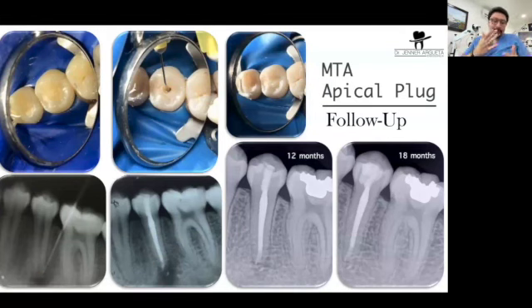Some people say, and this is important to analyze, because I have students, I have people that maybe I meet during my lectures, and they say, you know, Jenner, the microscope is nice, the microscope is good, but I have been practicing dentistry for 20 years, and I have good clinical results. If you only think about clinical results, maybe you will obtain good results, but you are not thinking about the health of the dental practitioner. And the microscope is a tool that mostly will provide most of the benefits to the dental practitioner. And we will see why.